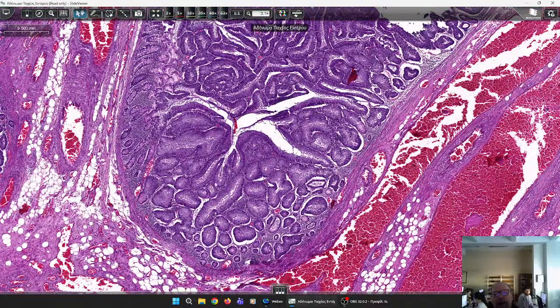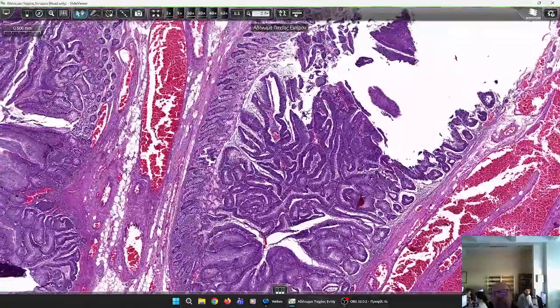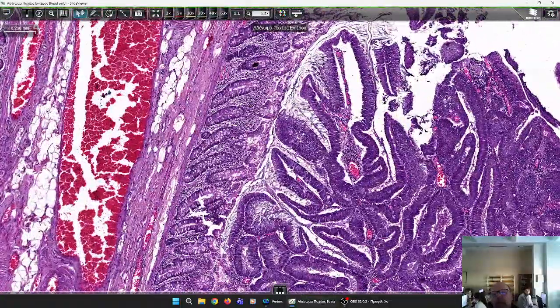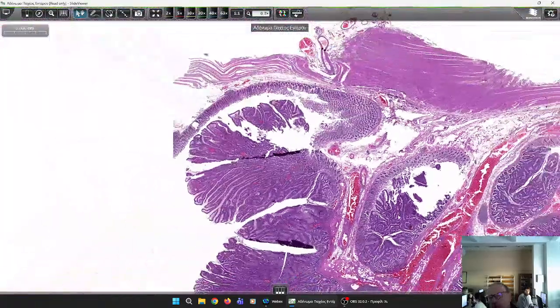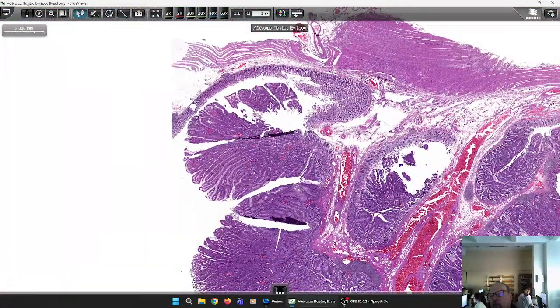However, it is not highly dysplastic. You can see also quite normal crypts and adenomatous crypts like this one. But more importantly, the whole contour is smooth. It is not invading. This could be some sort of a diverticulum, perhaps, something going down the wall of the intestine. Okay? So this is a benign adenomatous polyp.